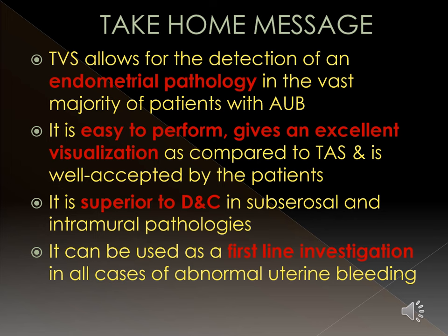Message: TVS allows for the detection of an endometrial pathology in the vast majority of patients with abnormal uterine bleeding. It is easy to perform, gives an excellent visualization as compared to transabdominal sonography, and is well accepted by the patient. It is superior to DNC in subserosal and intramural pathologies. It can be used as a first line investigation in all cases of abnormal uterine bleeding.